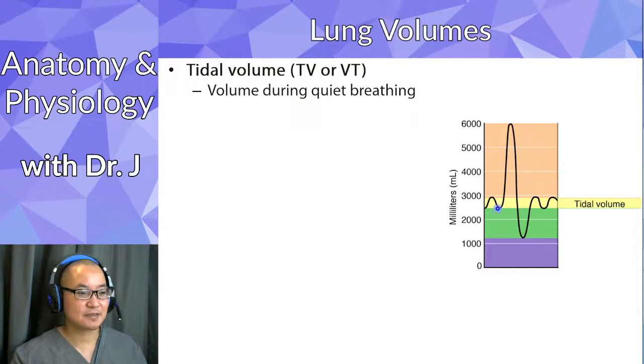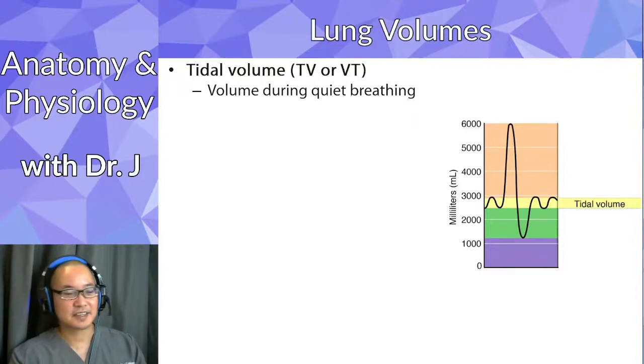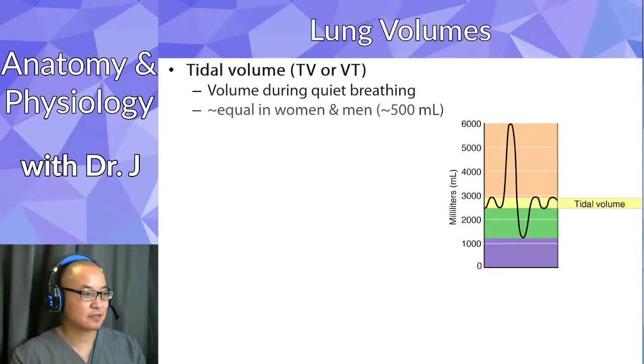But again, you're not going to force it past that point because you're doing that unconscious quiet breathing. So just that difference between that, I like to describe it this way. When you're doing quiet breathing, you measure from peak to valley, and that will give you your tidal volume. The peak is when you inhale during quiet breathing. The valley is when you're exhaling during quiet breathing. So it's just the difference between those that gives you your tidal volume.